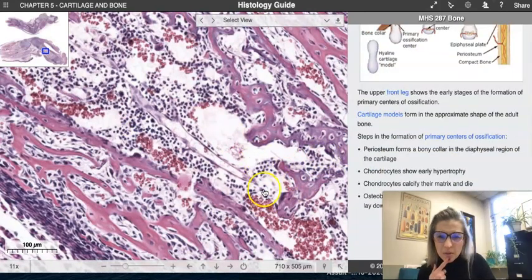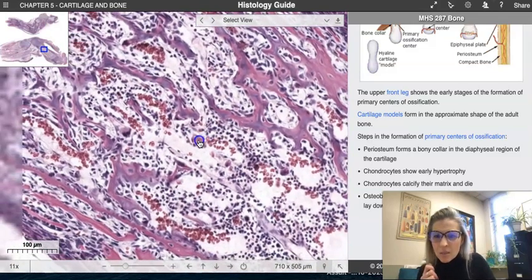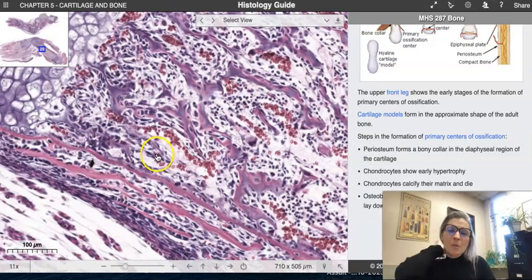I think on the upper epiphyseal growth plate slide, there's absolutely going to be some of those osteoclasts there. Even that guy right there is starting to look like an osteoclast to me. They stain just a little bit differently, and maybe that one. But I know on the other, because it's a little bit further in development, we would see potentially more osteoclasts. So that epiphyseal growth plate slide is where I'm going to tell you to also go. And in developing cancellous bone, or spongy bone, you can typically find some osteoclasts too. Okay, so I'm going to wrap this one up and go ahead and look at the epiphyseal growth plate.